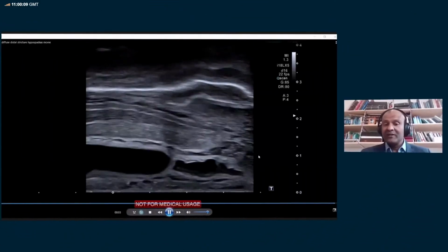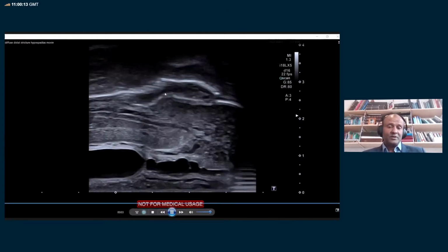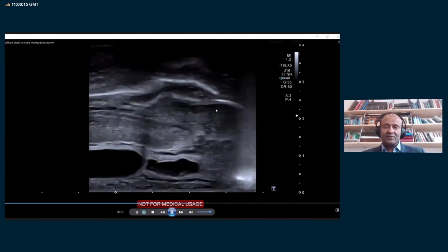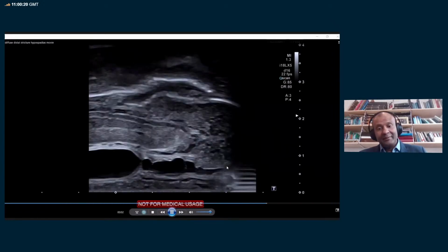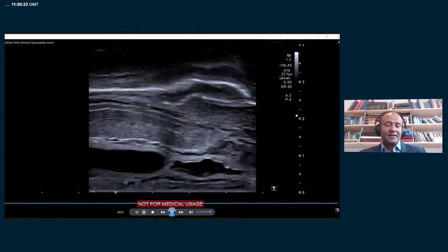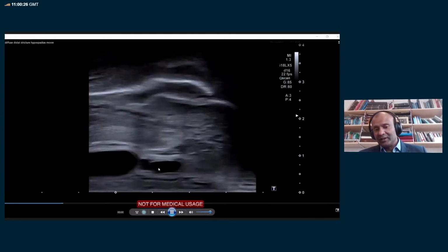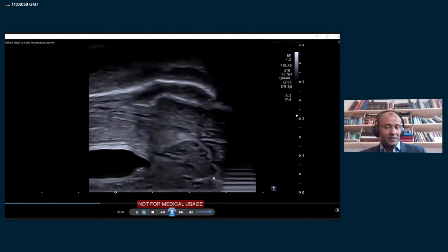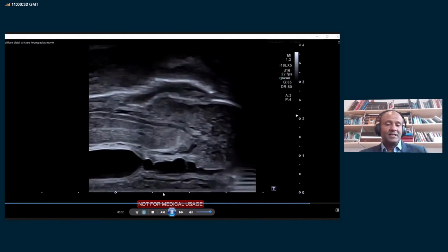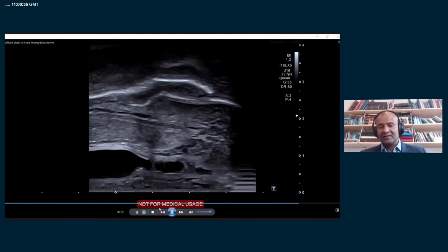This is someone that's previously had a reconstruction as a child. You can see the foreskin still there, nicely present, the prepuce. This is the corona. And again, you can see this is very abnormal because they've had repair as a child, often with preputial skin or scrotal skin, and it's very scarred. So again, with this case, you would excise all this tissue and then place more graft to reconstruct the distal urethra.